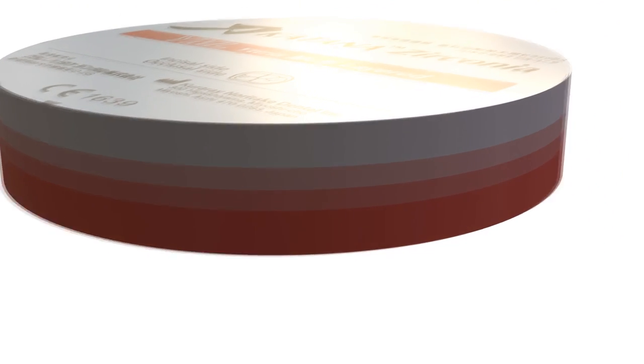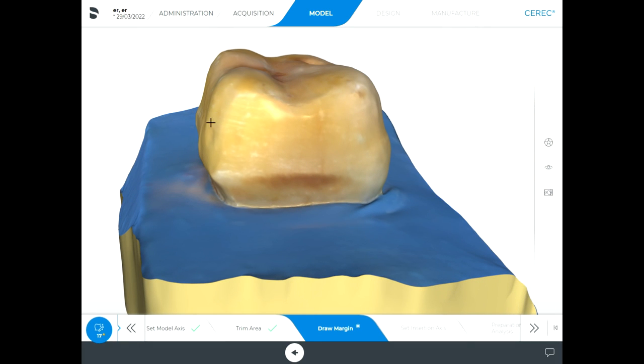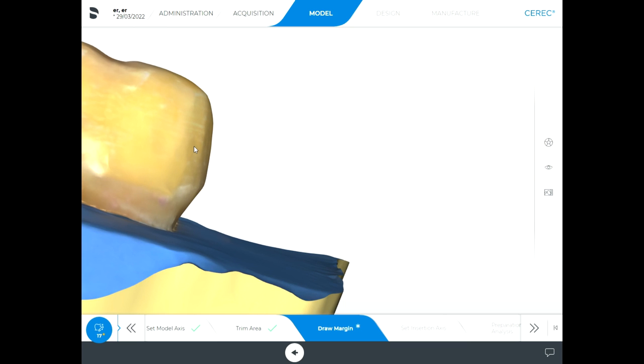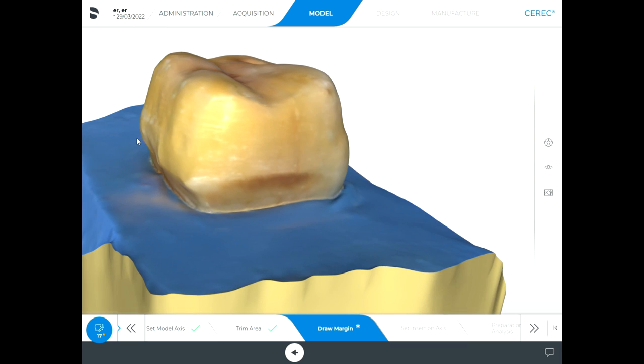Class 1, 2, or 5 zirconia may be thinned at the chisel margins to an extent without any fracture. A second negativity is over-extending crowns into the gingival due to the technician's inability to determine the crown margin line. To overcome this inconvenience, it is good clinical practice to draw a line with the tip of a flame burr indicating the crown margin.